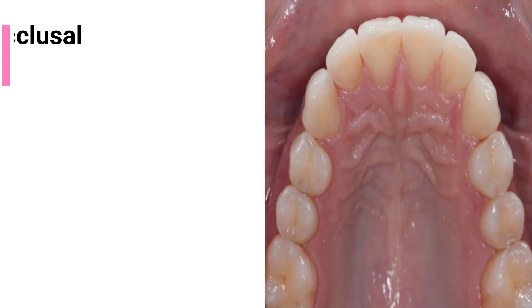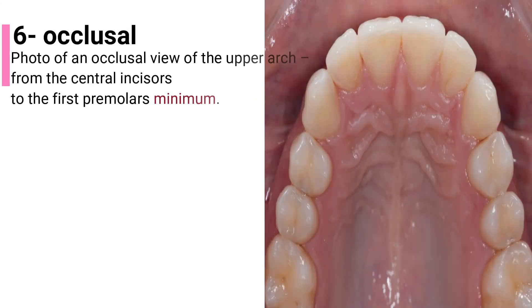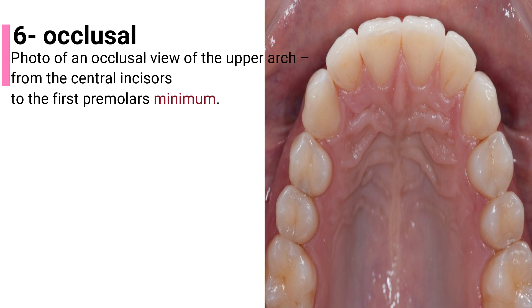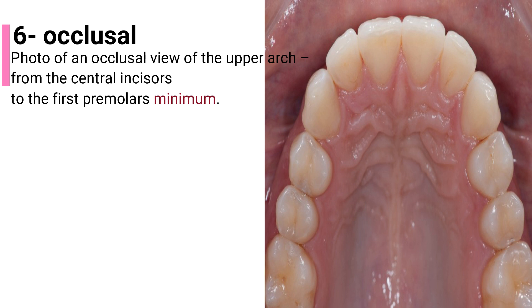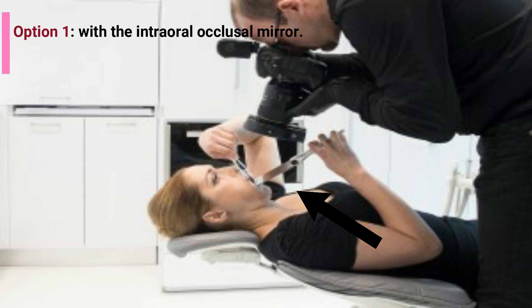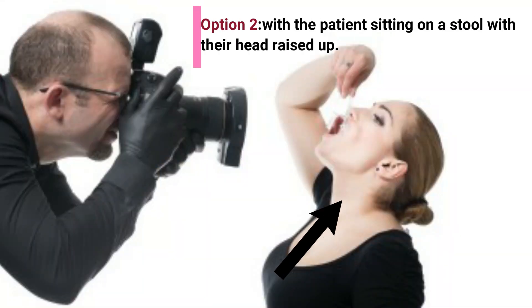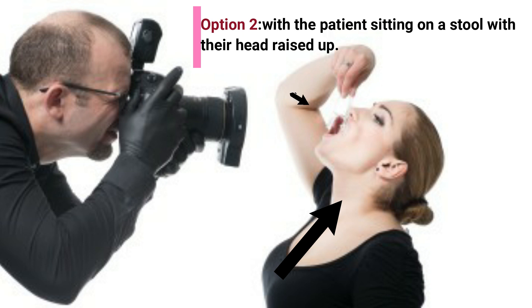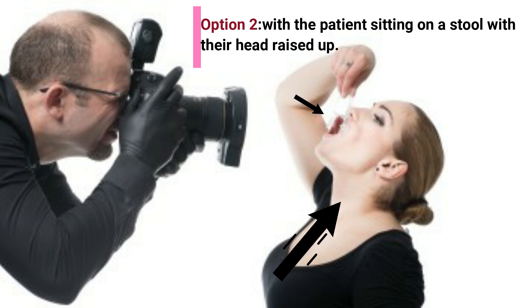The last photo is the occlusal one — a photo of an occlusal view of the upper arch from the central incisors to the first premolar zone. This can also be taken with two options: Option 1 with an intraoral occlusal mirror, or Option 2 with the patient sitting on a stool with their head raised up and the upper lip retracted.